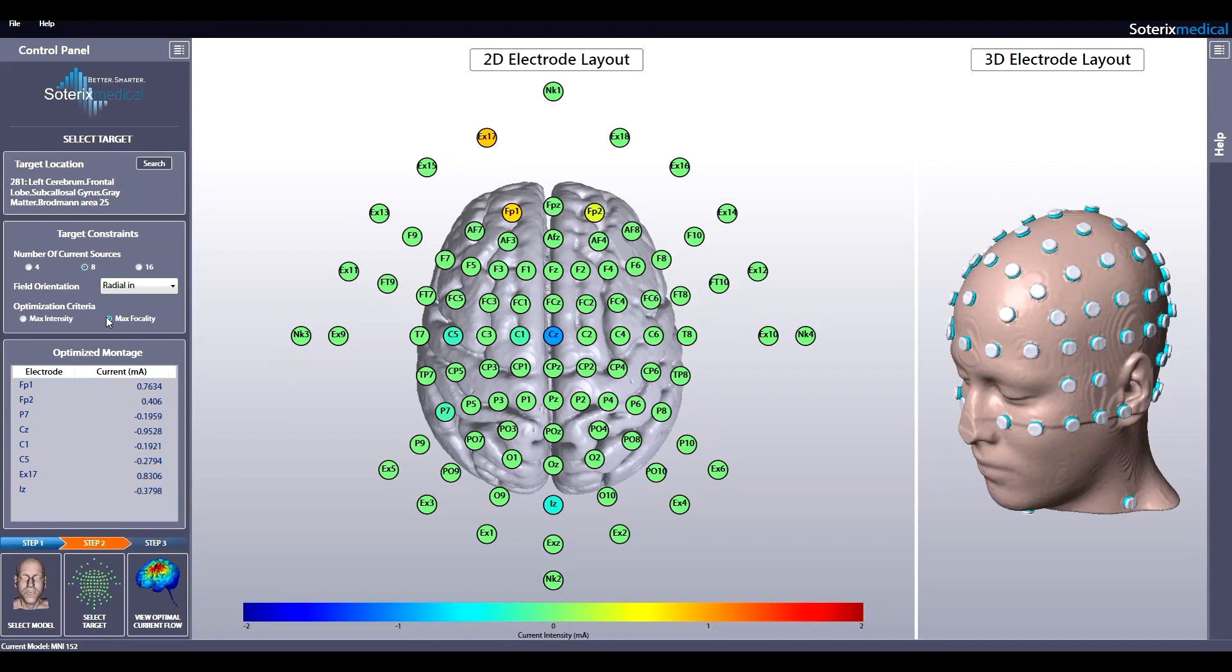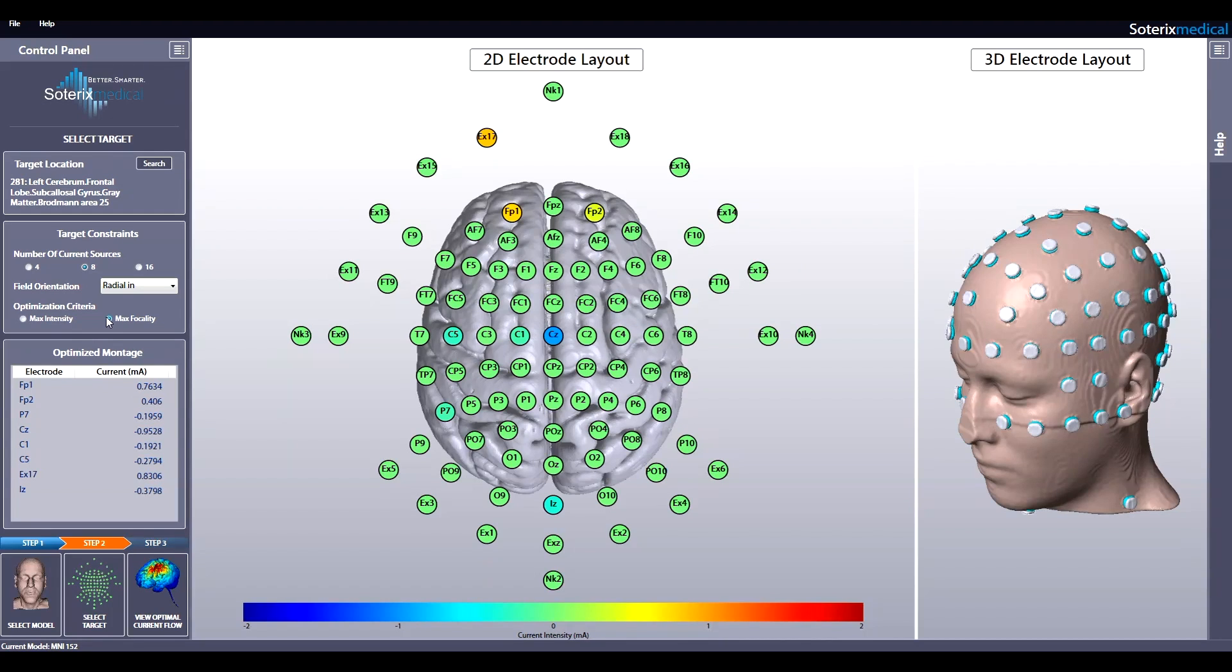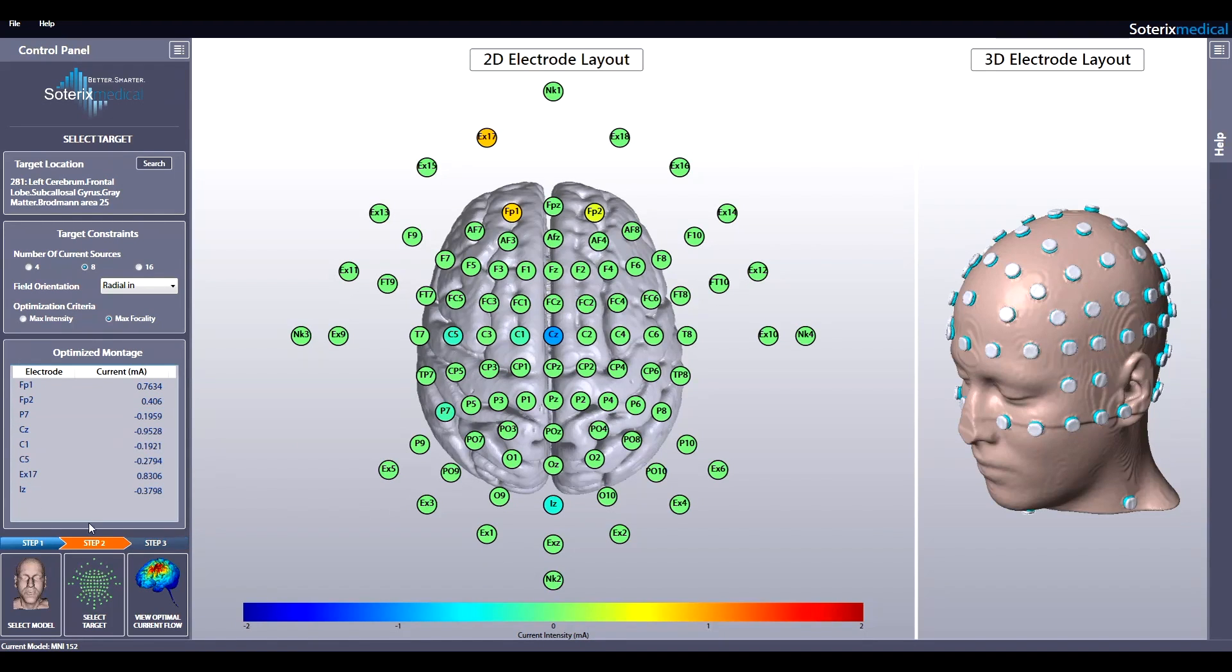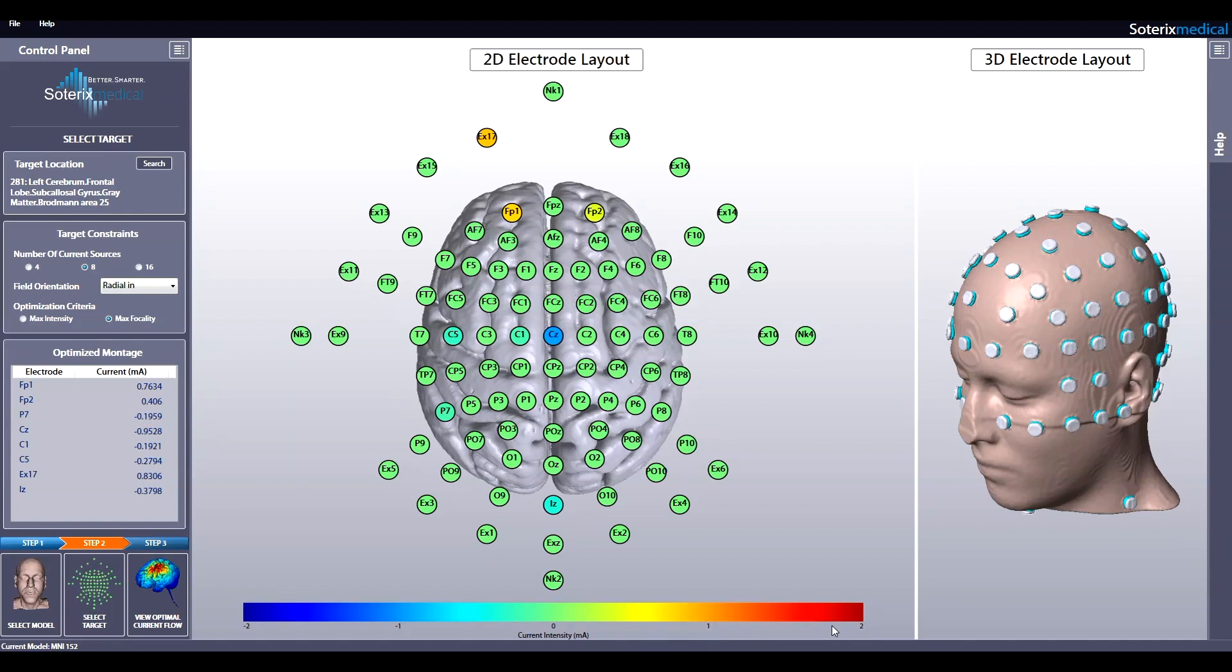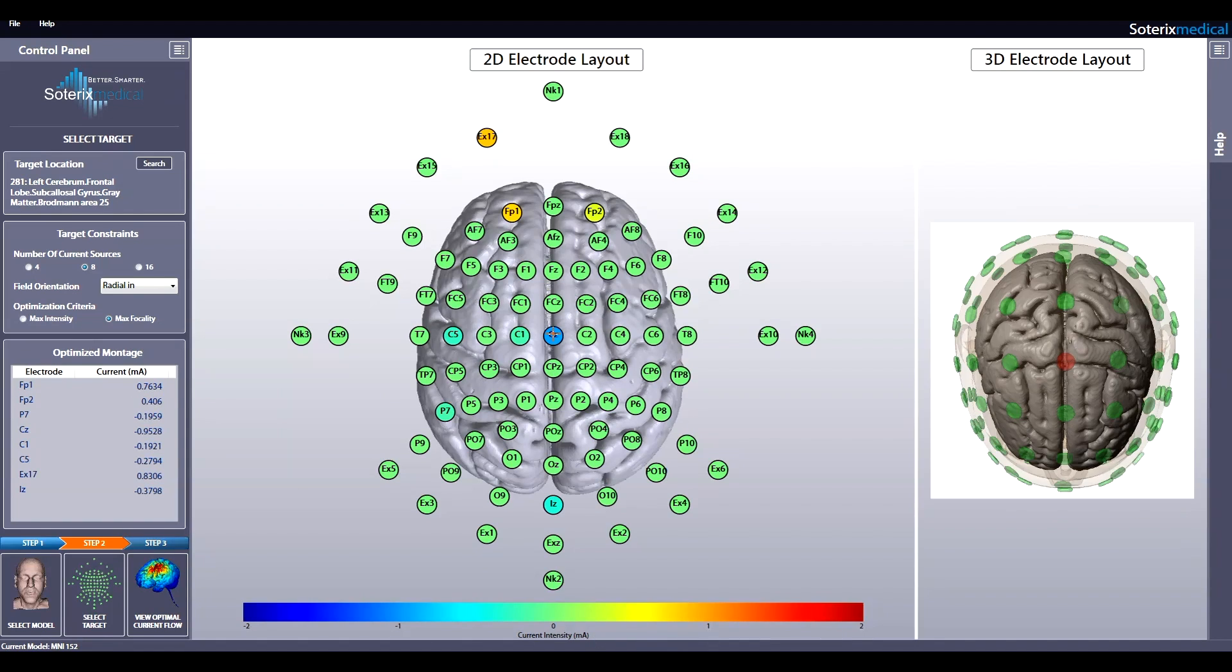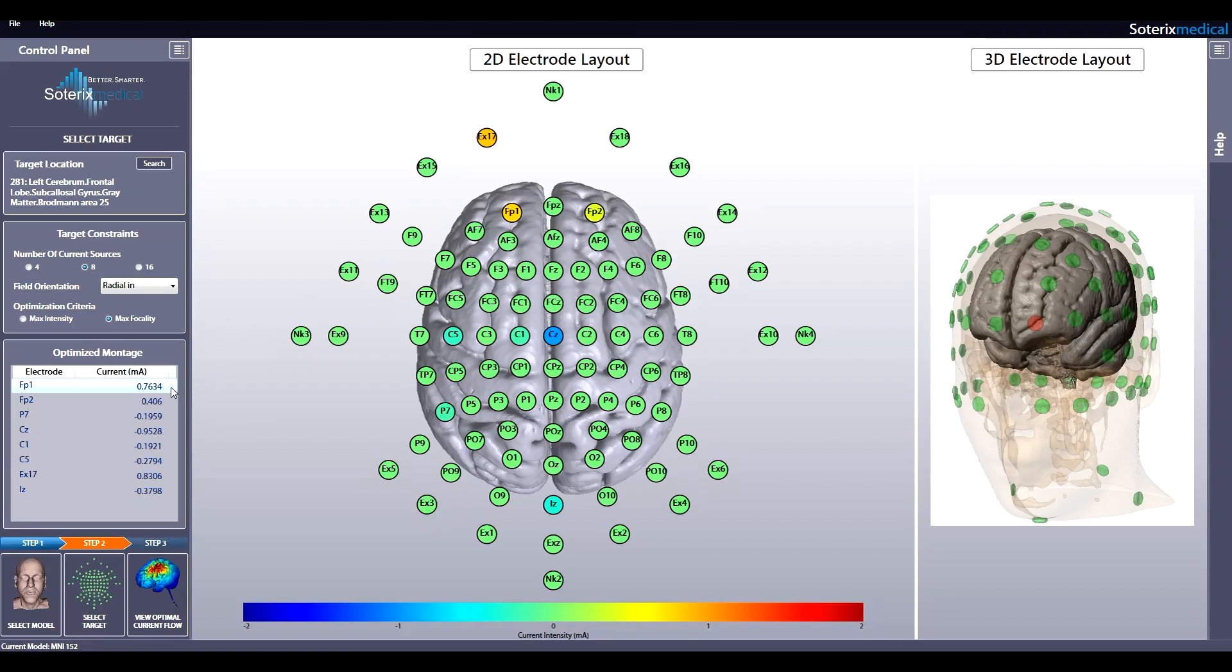Soterics Medical HD Targets automatically calculates the most optimal electrode montage based on the criteria you indicated. This is illustrated by the 2D electrode layout in the middle and by the optimized montage table on the left. For each electrode indicated, the current you need to apply to that electrode is indicated in the false color map. For example, electrode at location CZ will need to deliver negative 0.95 mA, while electrode at location FP1 will need to deliver positive 0.76 mA.